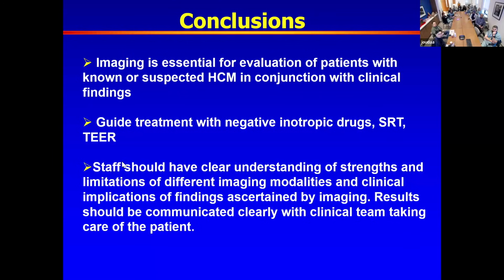Yep. So when I read these cases, I provide a biplane LVEF, and sonographers, after they've acquired the gradient, if they have a patient where it is challenging to see endocardial borders, will give contrast for us to be able to do the biplane EF. Yeah, we're starting to have a lot of patients on myosin inhibitors such as mavacamten.